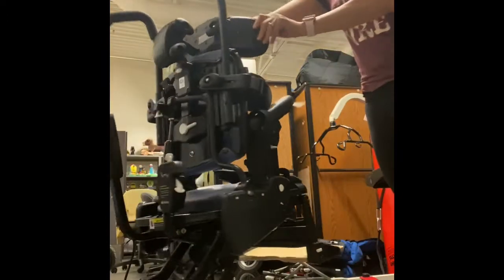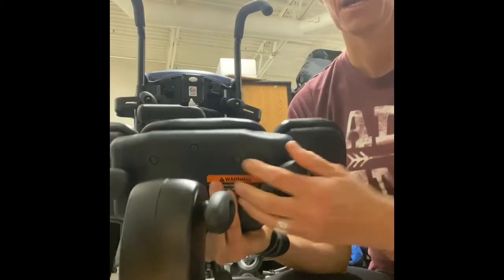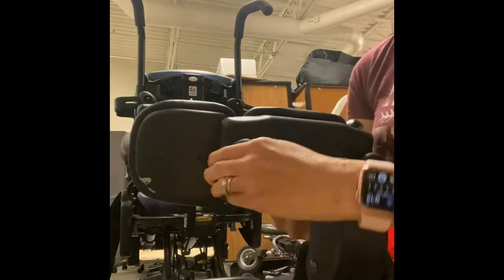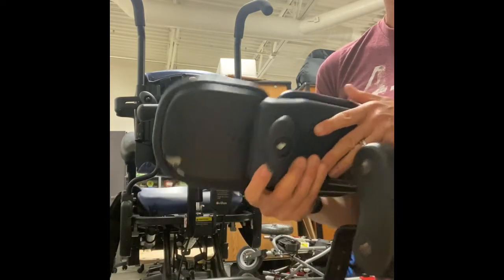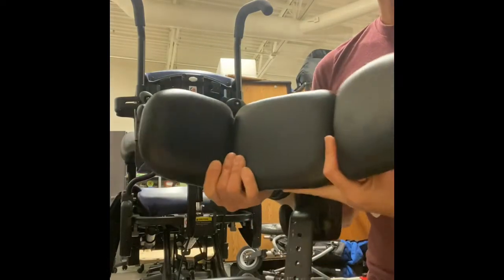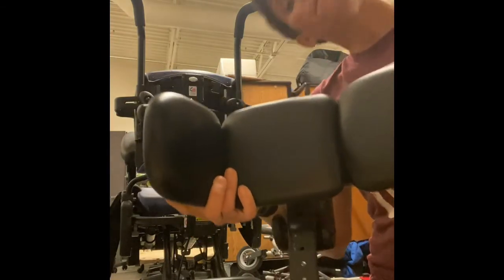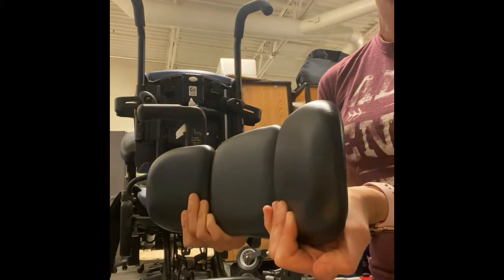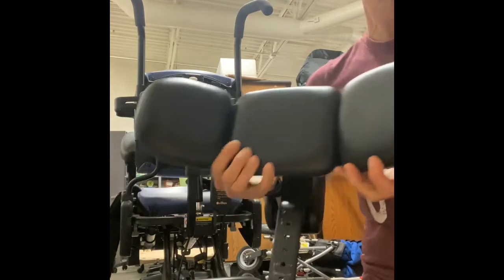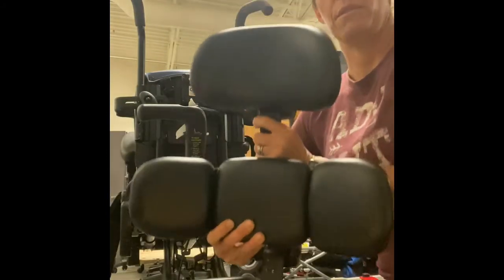To adjust the wings of the tri-panel headrest, take it off to get closer — each wing has its own knob to adjust. Lefty loosey, righty tighty, so as you loosen you can change the angle, and they're independent of one another. If a student turns hard into one side, we don't necessarily want to block that due to skin breakdown, but we may want to block them from falling to one side — so we can open one side and close the other, close both, or open both for a nice wide headrest.